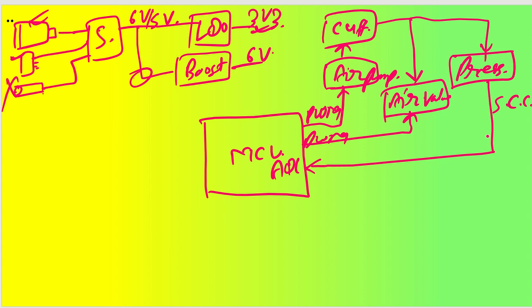Now we'll have some indication. Let us say we want to have buzzers for some alarms and error indications. So beep buzzers will be connected. This will also be driven through some PWM signal. So we'll have magnetic transducers. Let us say you can utilize one of the parts, a very good part that we have always used, CS951AP, which is from CUI Devices.